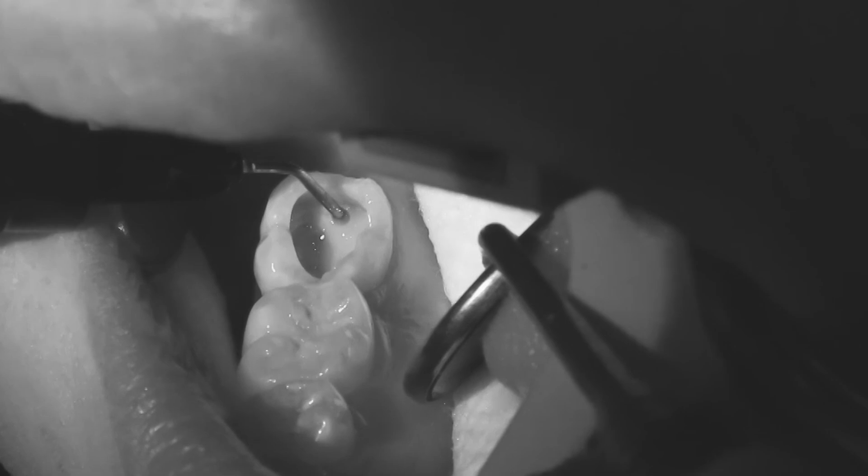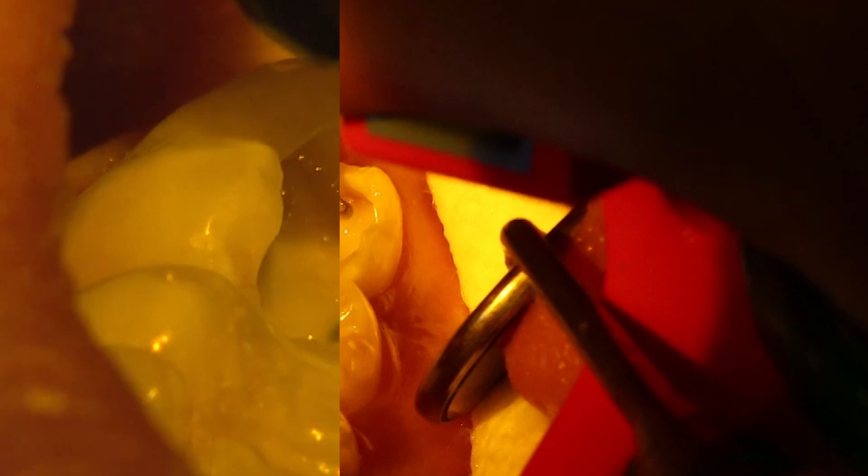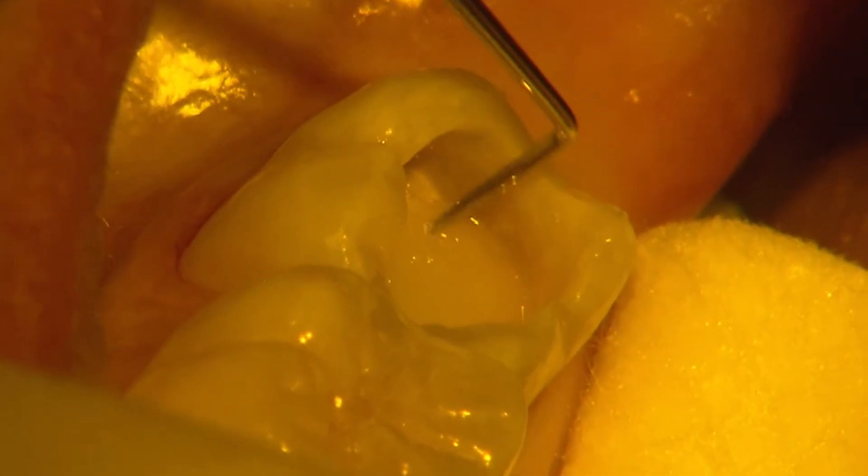I begin the restoration with a thin layer of flowable to adapt to the pulpal floor, then build up the restoration with A1 enamel. The material is very easy to adapt to the cavity walls and shape to the desired form. I place and cure each cusp's support individually.